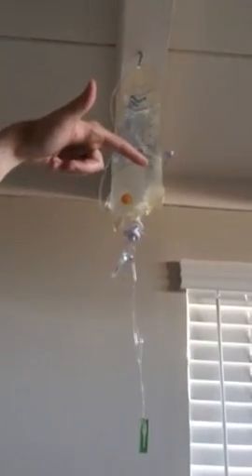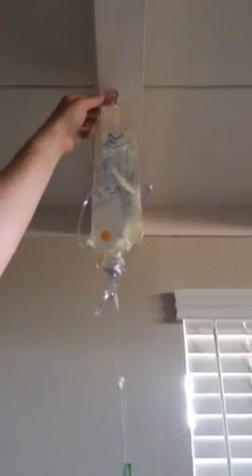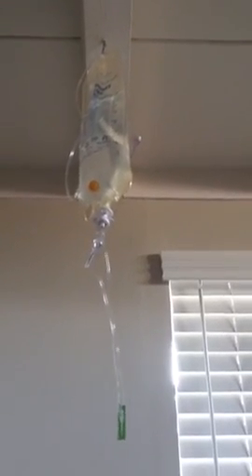We usually leave the needle on until the next time, just so we always remember that the first step is to change it. Just coil it up and put it up here — now it's ready to go for tomorrow. When this bag does run out, on the day you get to the last level it'll just be empty. I have a little hook up here where you can take the new bag and hook it up, so that's pretty much it.